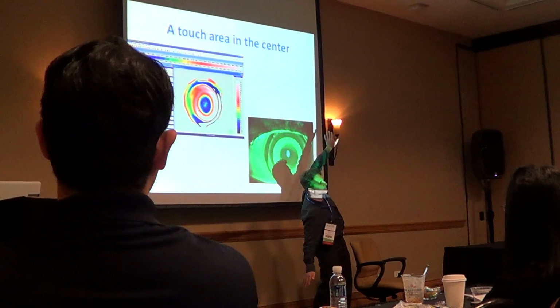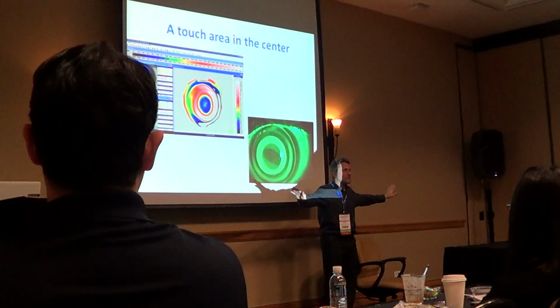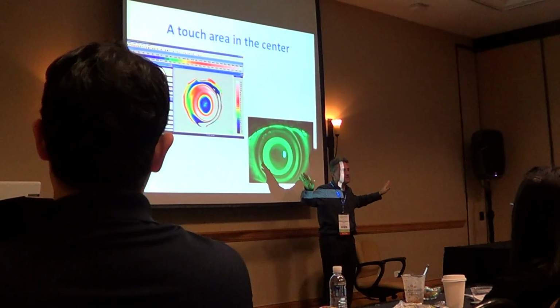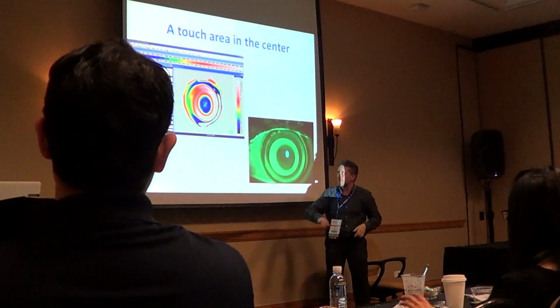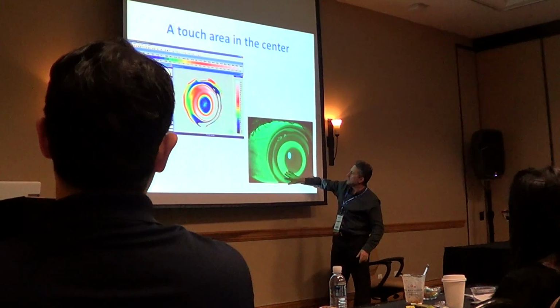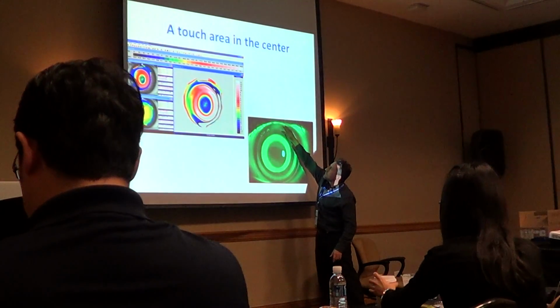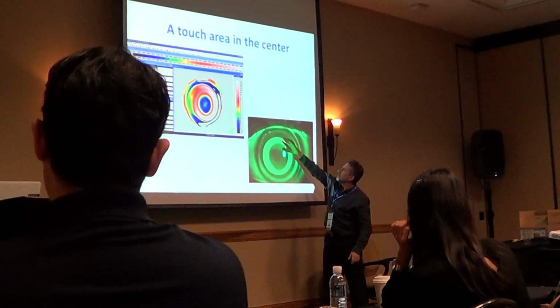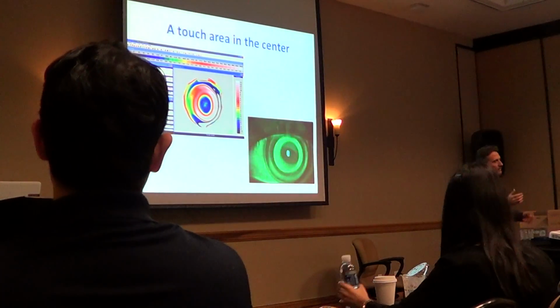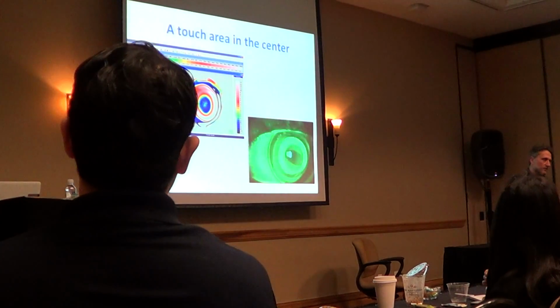The lens is moving like this. So if you center the lens, you will have similar flat alignment. So horizontal is too flat, it's touching the center. Now, up and down, you see some green here and again here, okay? So in vertical it is as well a little bit flat, not so much, and the diameter maybe is quite small.